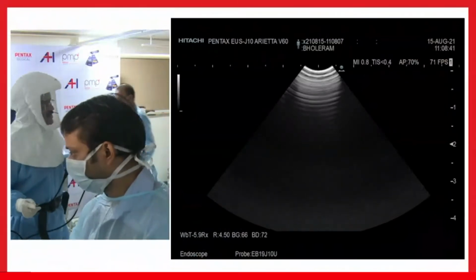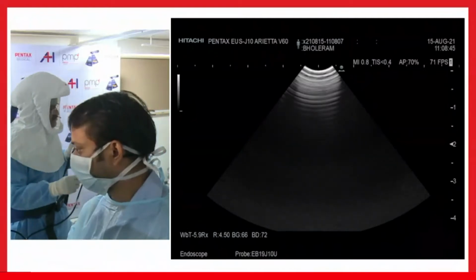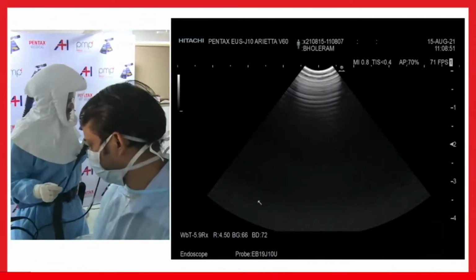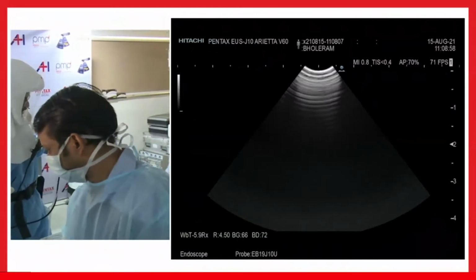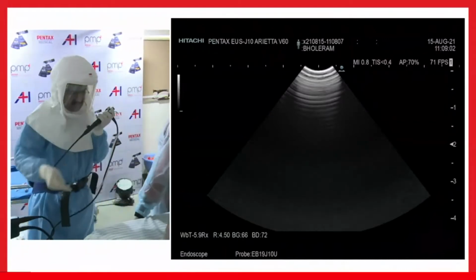And he has a right upper lobe mass of 3 centimeters with spiculated margins and small paratracheal FDG positive lymph nodes. So we will try to see if we can do justice in this patient to take the FNAC from this small paratracheal lymph node or any other lymph node we could find in this case.